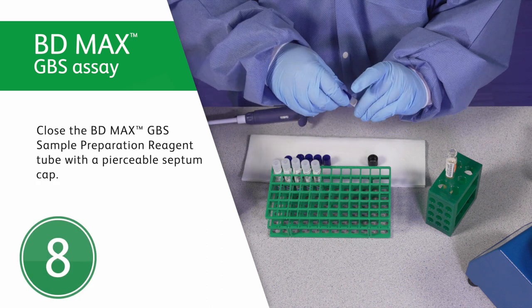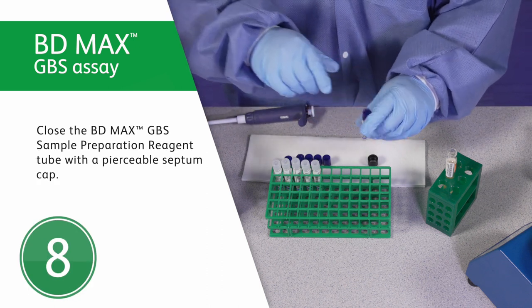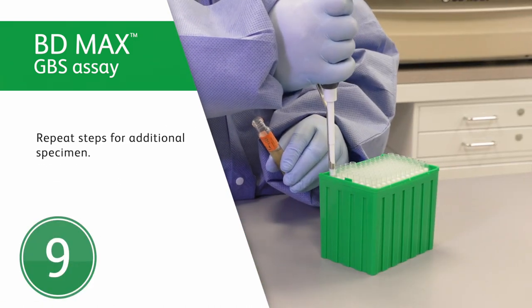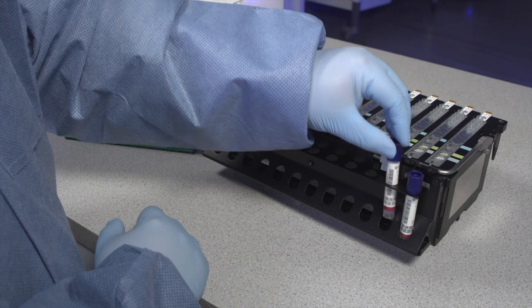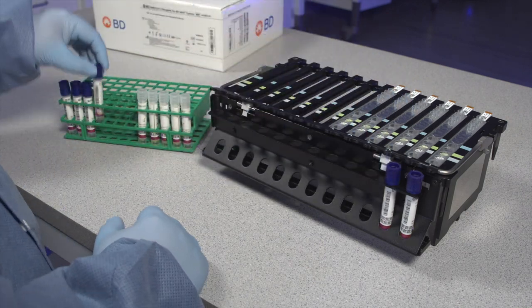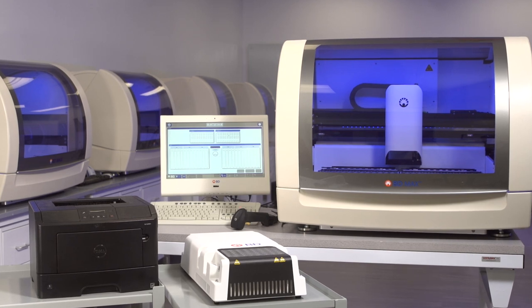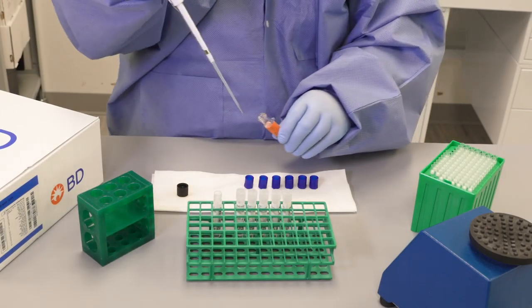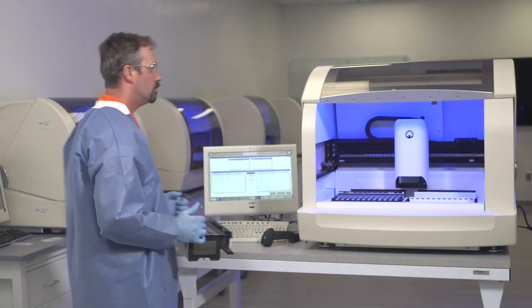Finally, close the BD-MAX GBS sample preparation reagent tube with a pierceable septum cap. Prepare any additional specimens for testing. Now, proceed to the BD-MAX System Operations section in the User's Manual or assay-specific Instructions for Use to perform testing of the BD-MAX GBS Assay on the BD-MAX System. We hope this program has helped familiarize you with proper specimen preparation of the BD-MAX GBS Assay.